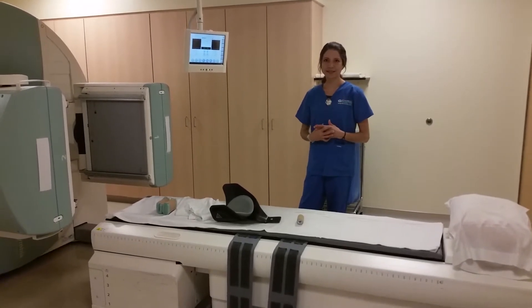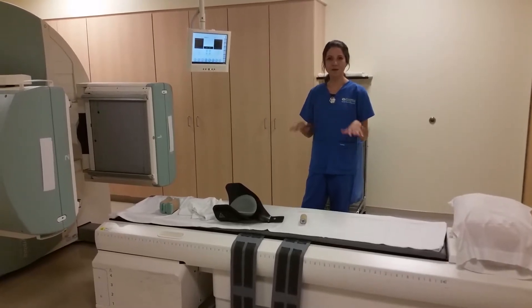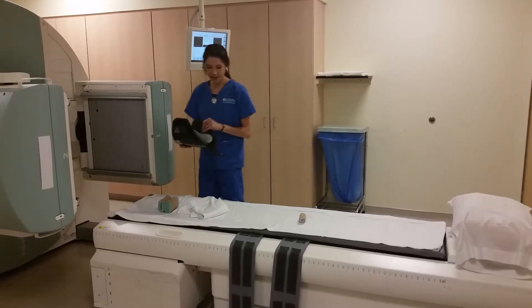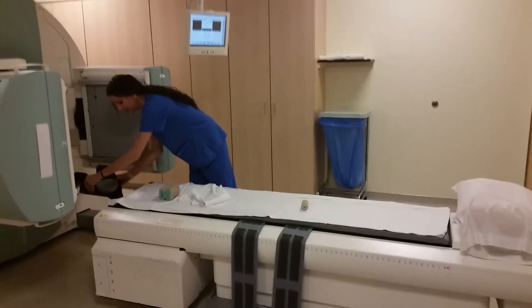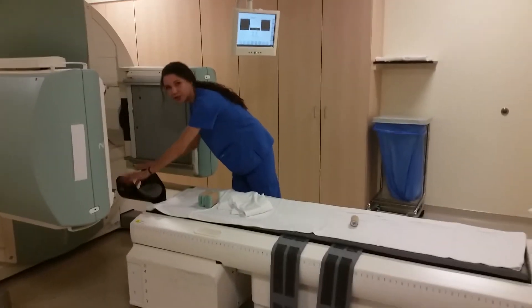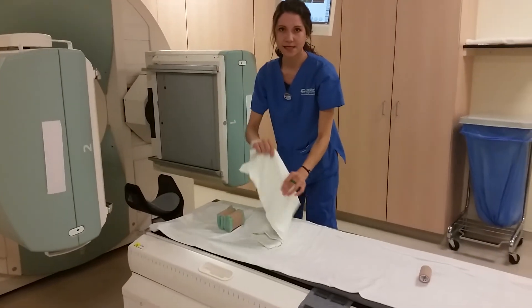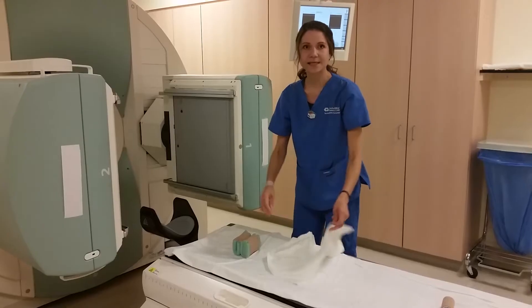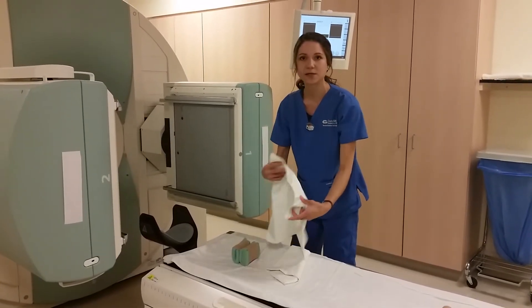We are going to show you a DAT scan. The patient is here, so I'm just going to get it set up before I start the imaging process. We have a headrest right here. For a DAT scan, we are scanning their brain to see if the reason that their tremors are from essential tremor or if it's Parkinsonian syndrome.